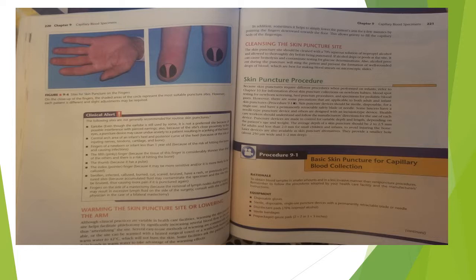Some facilities ask the patient to wash their hands in warm water to take advantage of the warming effects. In addition, sometimes it helps to simply lower the patient's arm for a few minutes by pointing the fingers downwards towards the floor. This allows gravity to fill the capillary beds of the fingertips.